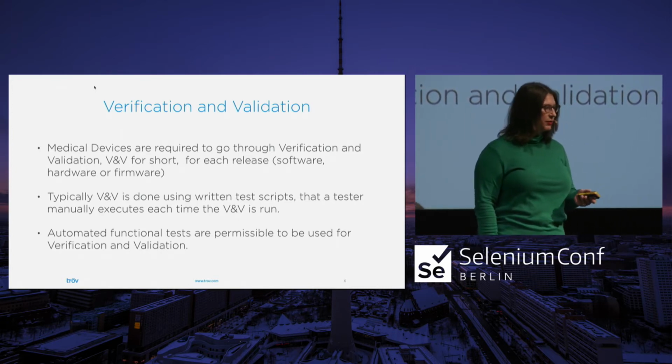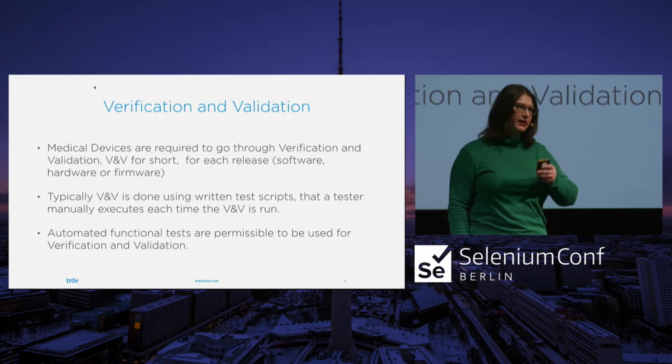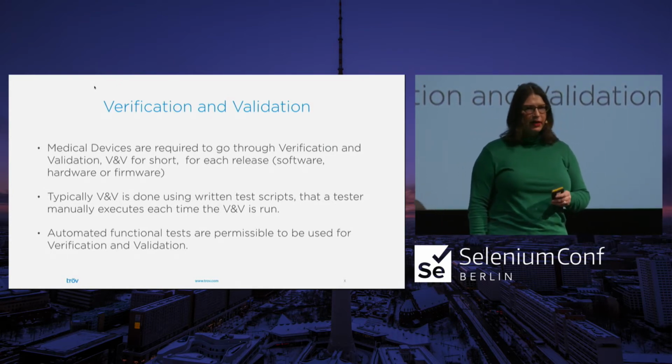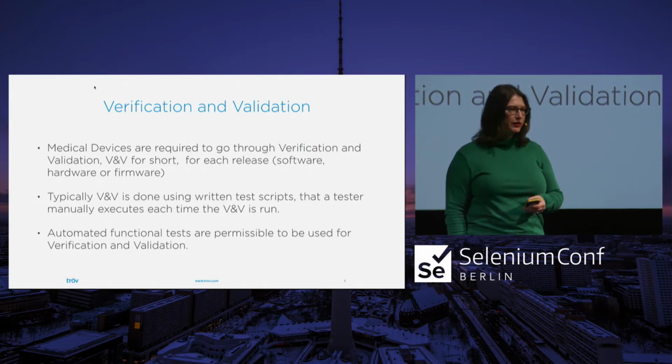Automated functional tests are permissible to be used, but they need to be written in the same format. They need to be human readable, because the people that are going to analyze your document and make sure you've covered all of your requirements cannot read code.